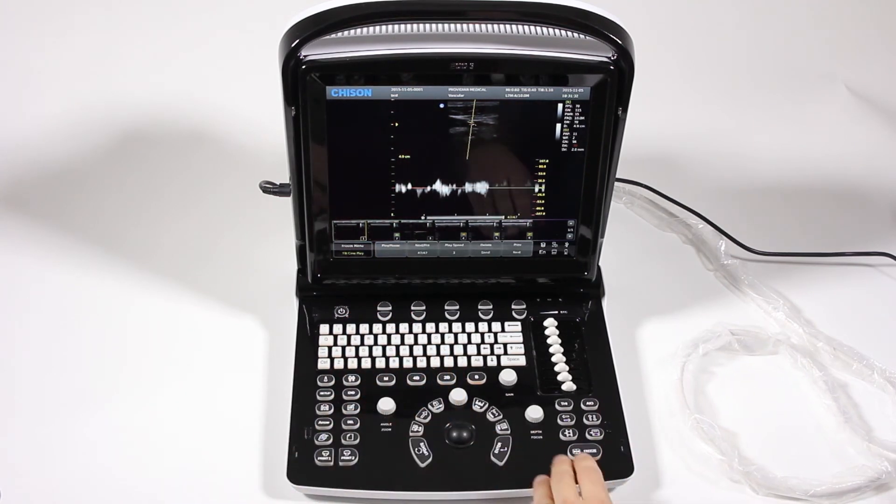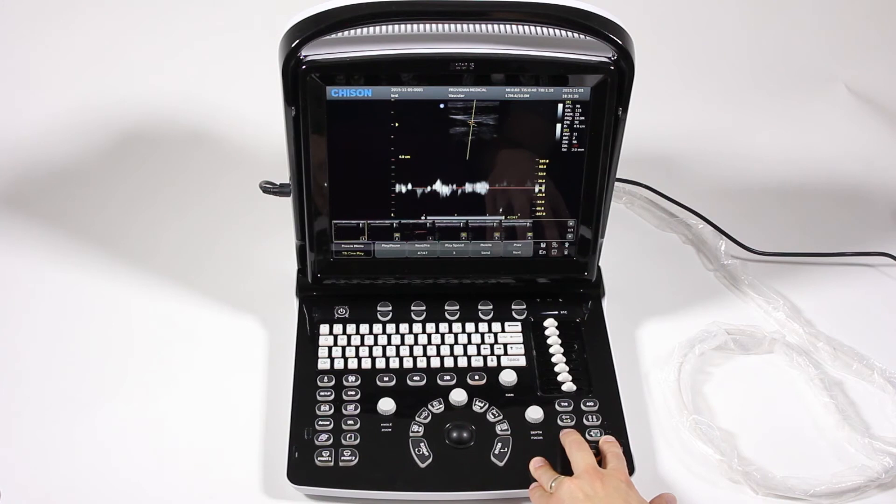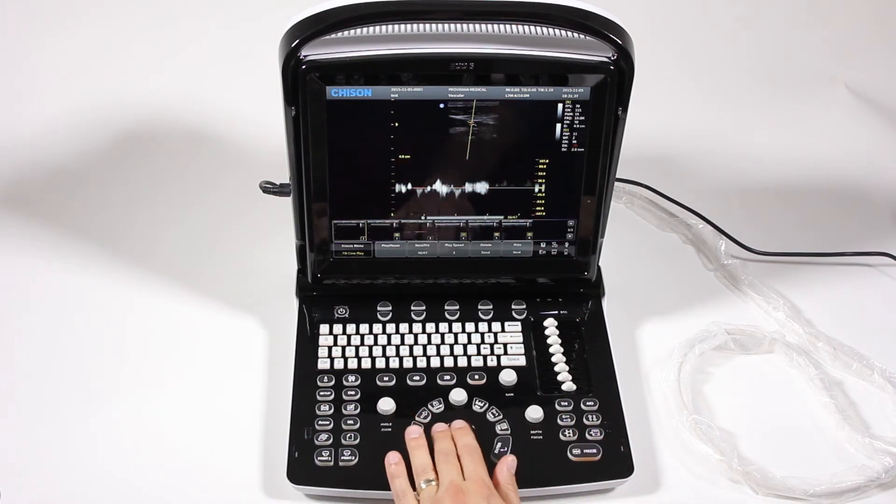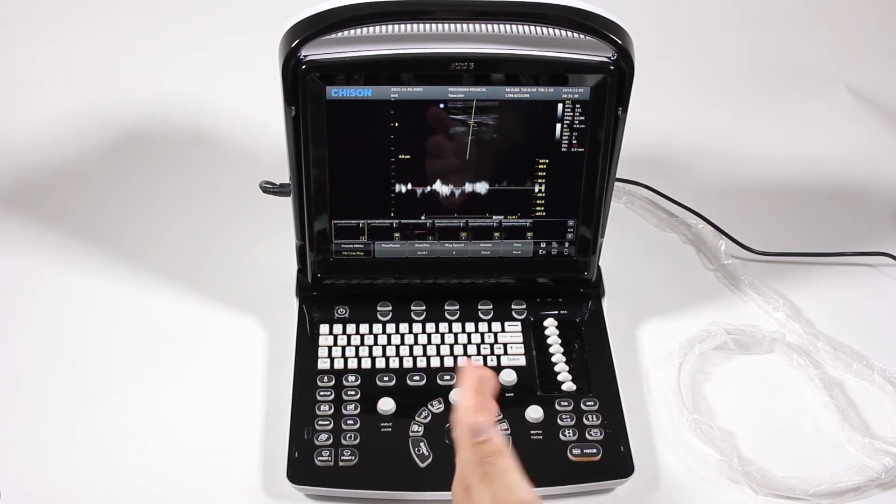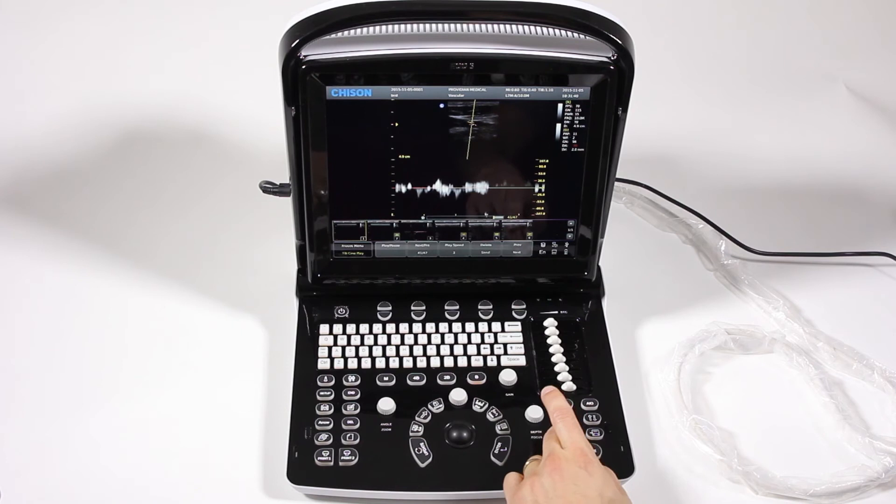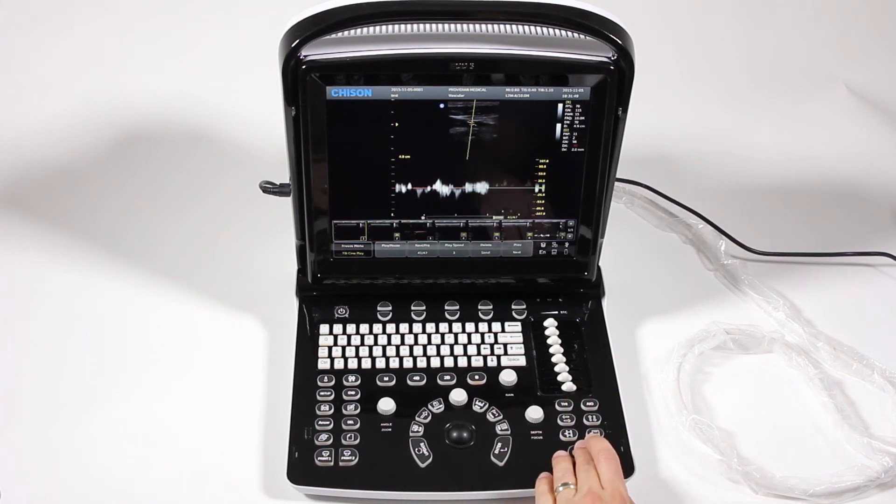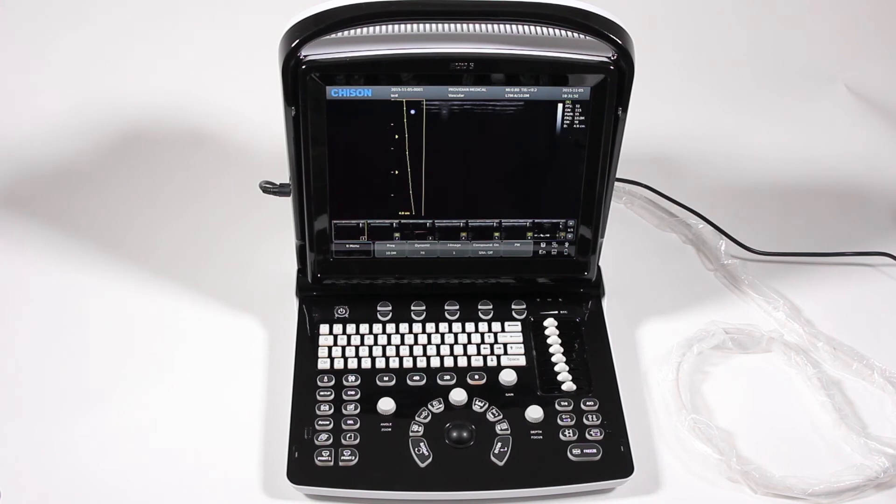And everything else would work very much the same, where you want to save images, or save an entire clip, or just choose a portion of the clip to save. And then you go ahead and hit that save. Then you can just unfreeze, and hit B to go back to regular B mode.